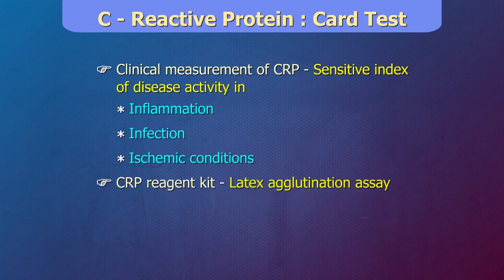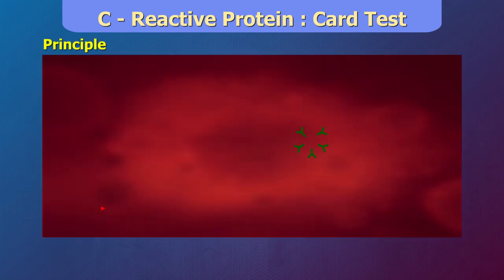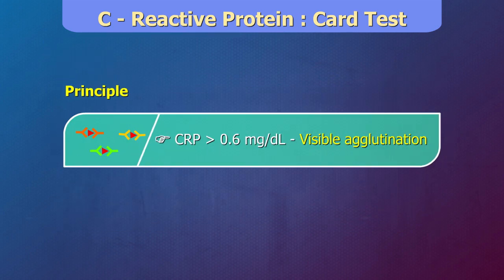The CRP reagent kit is based on the principle of latex agglutination assay. Principle: the CRP reagent kit is based on an immunological reaction between antibodies against CRP bound to biologically inert latex particles and CRP in the test specimen. When serum containing CRP greater than 0.6 mg per deciliter is mixed with the latex reagent, visible agglutination occurs.